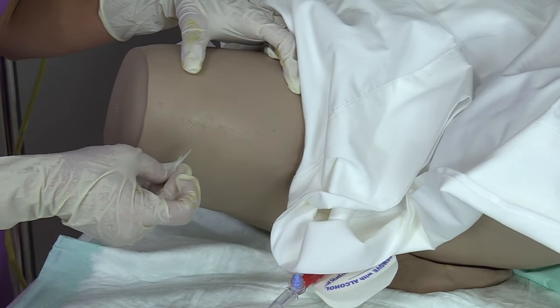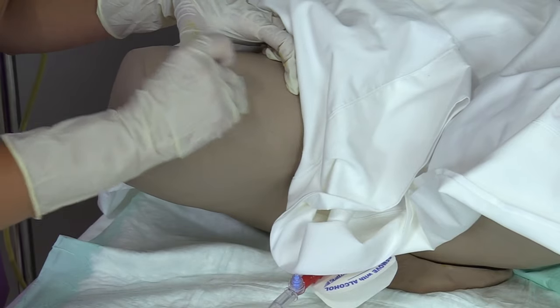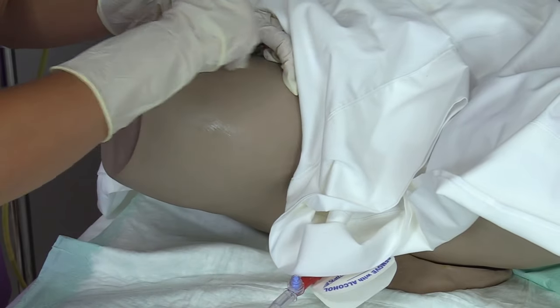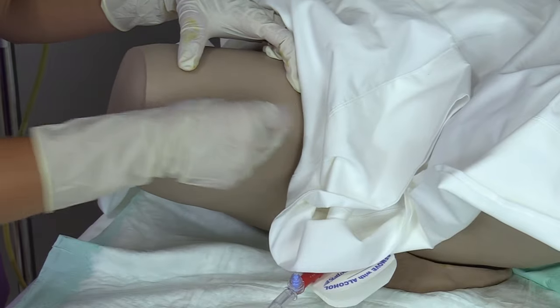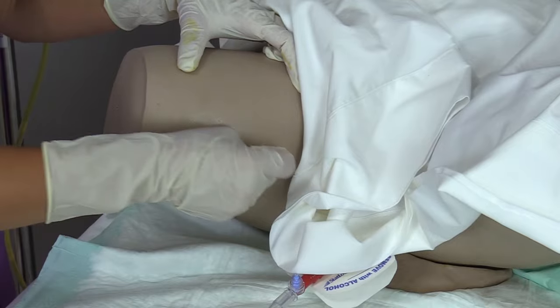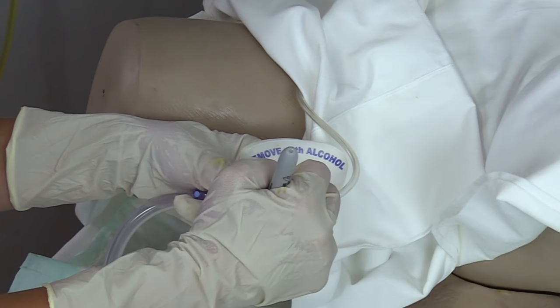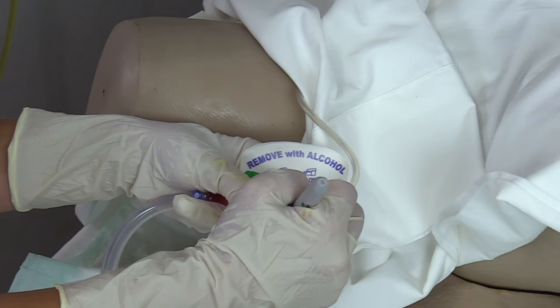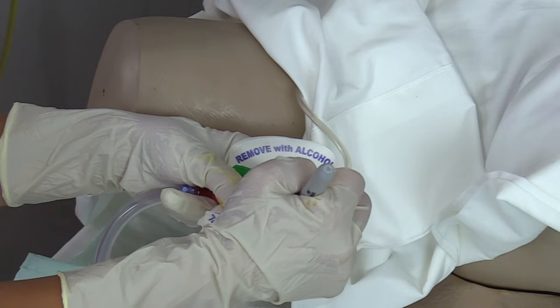Now that that has dried completely, I'm going to take the skin prep and clean that whole area again. This is a protectant to protect the patient's skin because these STATLOK devices stay on the skin for a while, especially with an indwelling catheter. You want to change these STATLOK devices out according to your facility's protocol — it's usually about every seven days. While you're waiting for the site to dry, put your initials and the date so the person behind you will know when to change it out.